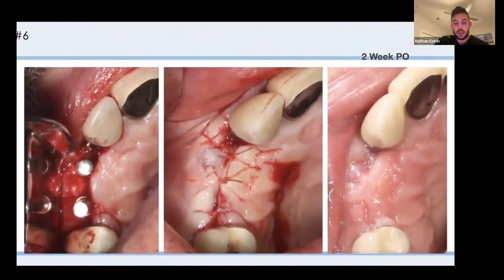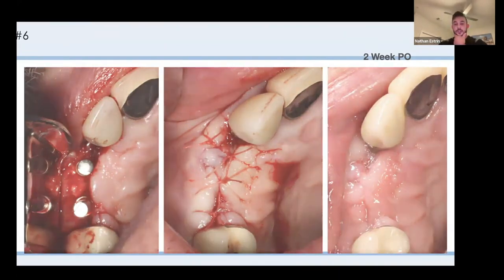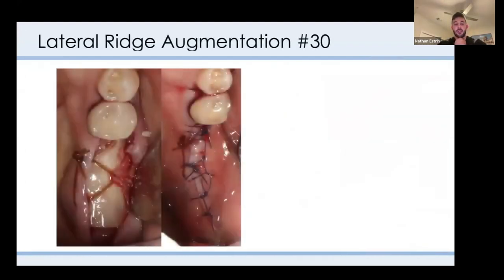Okay. And then here's just very straightforward implants at sites 5 and 6, but look at the incision line. This is a case where no PRF was used, just Stella Life, and the incision line looks very mature. And this is probably the case that really made me a believer in Stella Life and what prompted me to write that article and that review article.